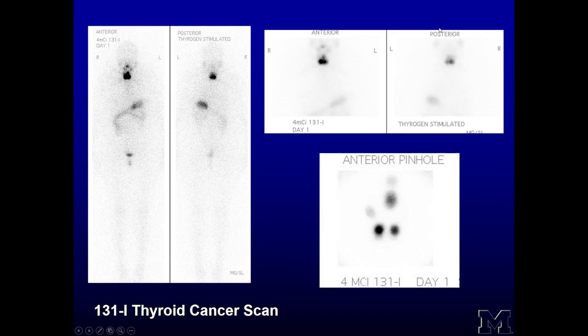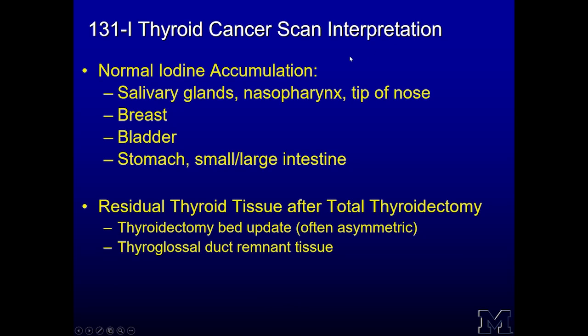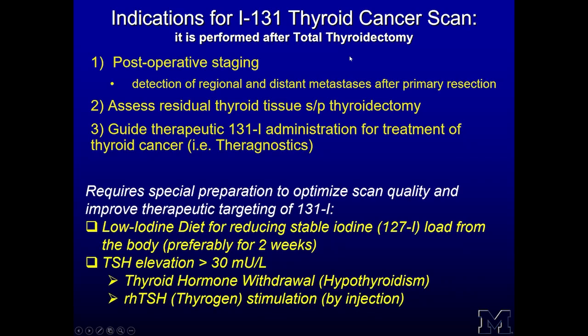It is always performed after total thyroidectomy. The first indication is for postoperative disease staging, for detection of regional and distant metastases after primary resection. The second indication is to assess residual thyroid tissue after total thyroidectomy and for guiding therapeutic iodine administration for treatment of thyroid cancer.